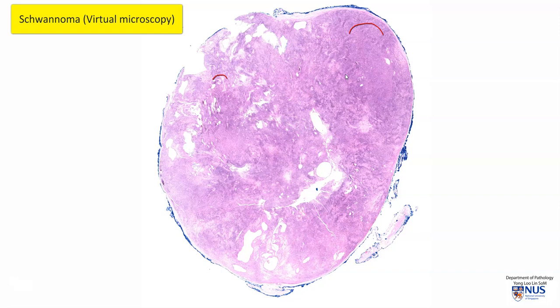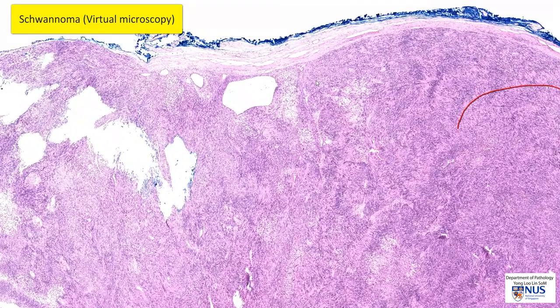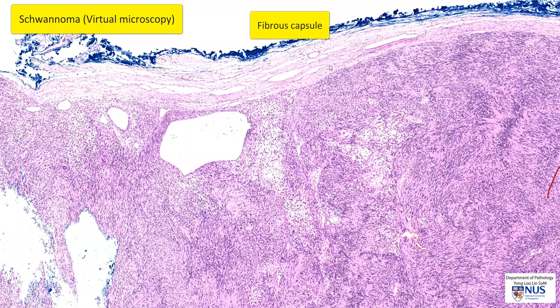The cells are very spindled in nature, and we will have a look at that when we zoom in later. But first, I would like you to appreciate the low power appearance — this is a very well-circumscribed oval-shaped mass. At the periphery, we can actually see a fibrous capsule.